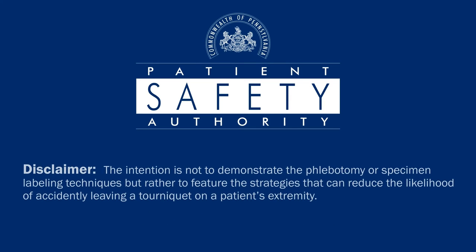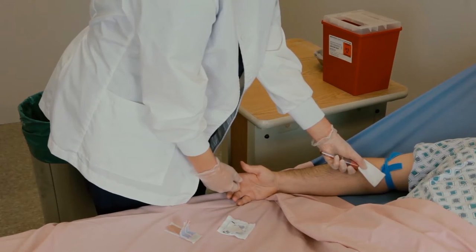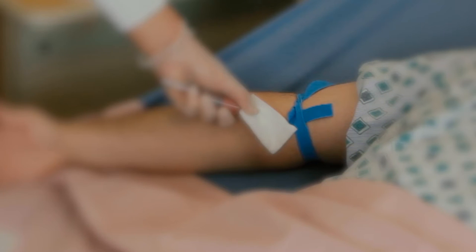This video is a simulation of a phlebotomy already in progress from the point of successfully accessing the vein. The intention is not to demonstrate phlebotomy or specimen labeling techniques, but rather to feature strategies that can reduce the likelihood of accidentally leaving a tourniquet on a patient's extremities. Notice the color of the tourniquet — brightly colored tourniquets are more easily seen and distinguishable from gown sleeves and other equipment.